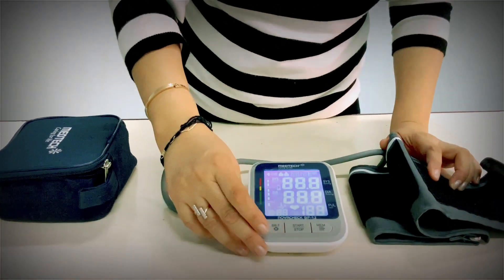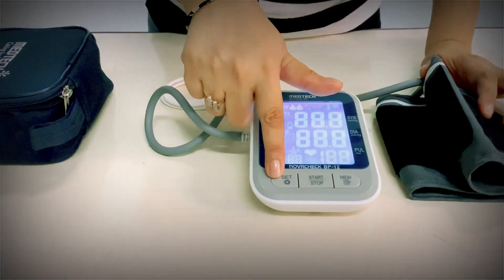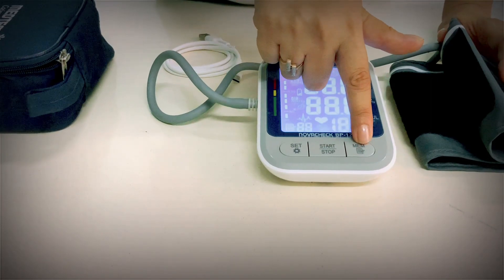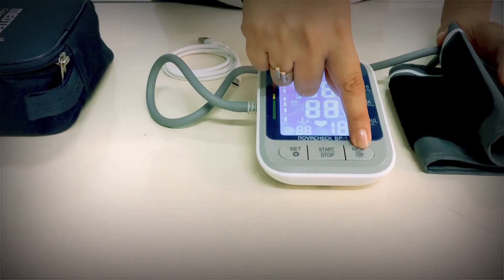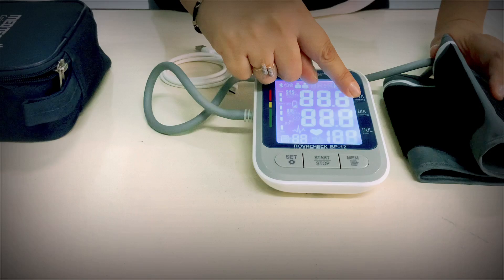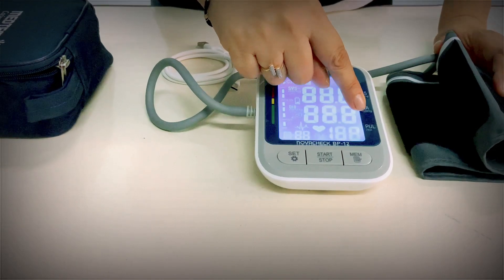There are three buttons. One is for setting, one is the start and stop button, and one is the memory button to access the previous record. On the screen display, you will have recording of systolic blood pressure, diastolic blood pressure, and pulse.